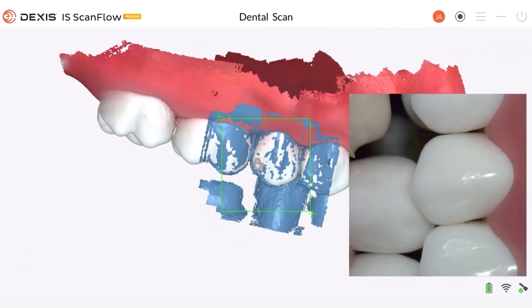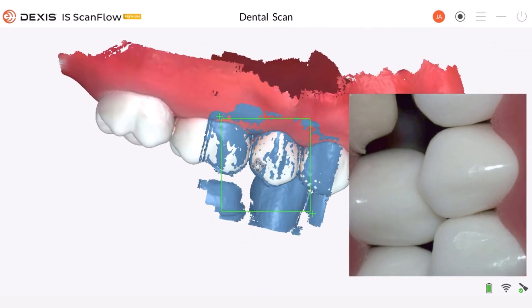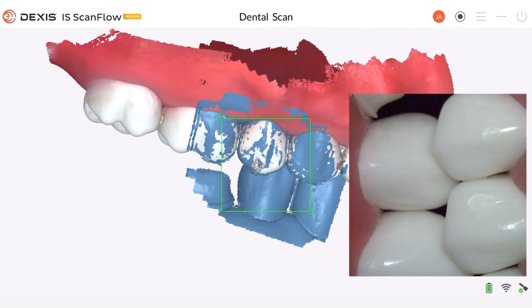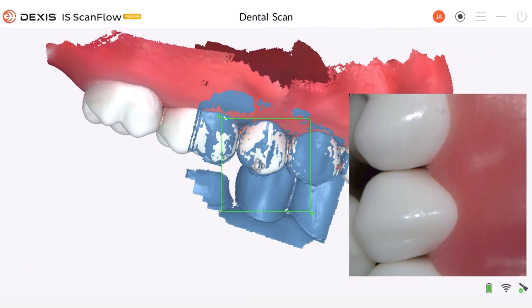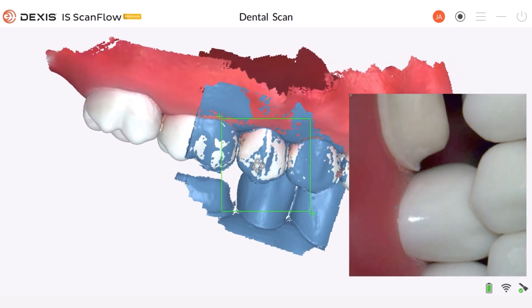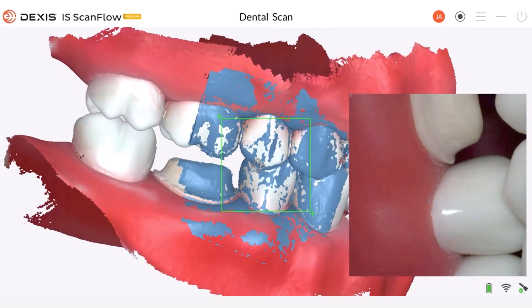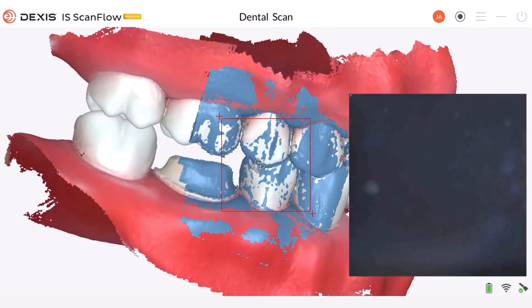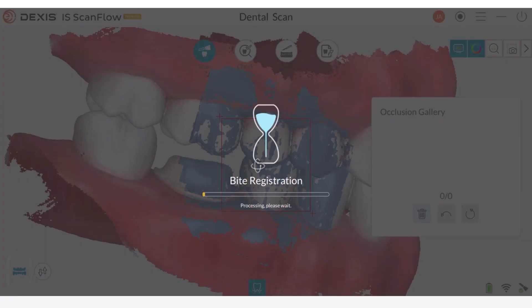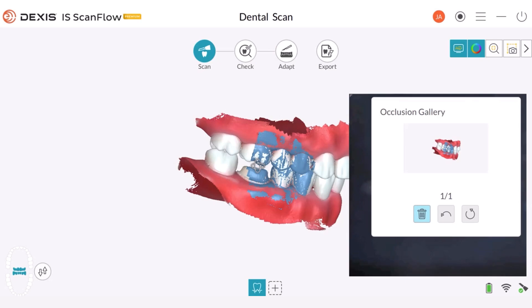Position the scanner in the center of the occlusal plane. While touching the teeth, glide the scanner up and down, past the gingival margin, until the two arches come together.